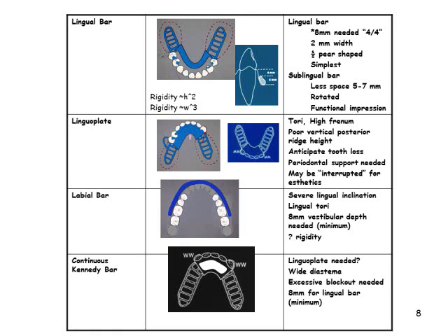Mandibular lingual plate is used when less than 8 mm of space exists between the free gingival margin and the elevated floor of the mouth. It is used when extra bracing is required, when the residual ridges in a Class 1 arch have undergone such vertical resorption that they will offer only minimal resistance to horizontal rotations of the denture. It is used to support periodontally weakened teeth and group function. Also, when the future replacement of one or more incisor teeth may be anticipated.